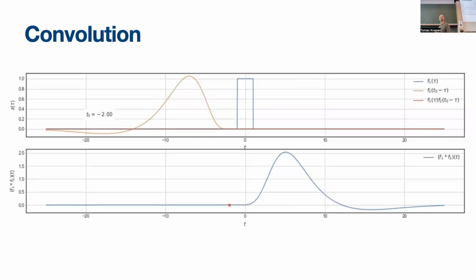This is the same operation, but it is happening in time. We have a neural activation here, a BOLD response that we get from this, and what this hemodynamic response function is. How do we create a prediction from the combination of our neural response and a BOLD response that we assume? We convolve them.